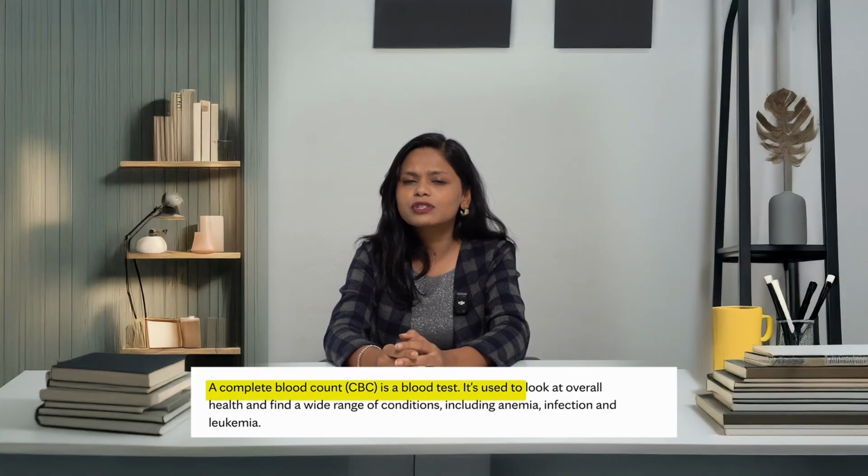If someone has a phase angle below 2, then it is an alarming situation and the person has to get checked immediately. If a person has a phase angle between 2 to 4, then again monitoring is required. There may be a certain underlying illness which can be checked through a CBC report. Lastly, phase angle is nothing but something which is telling you the cellular integrity. It is telling how elastic the membrane is, how good the cell health is. That's why a lot of research is done using the phase angle.